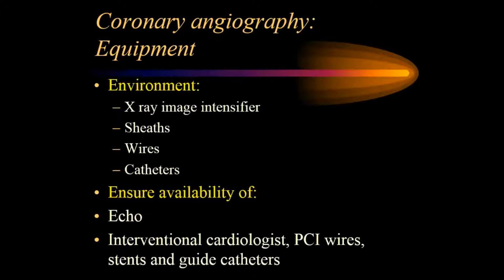And ensure the availability of echocardiography within the cath lab. You need an echo machine, a portable echo machine in the cath lab, in case you need to test for the development of tamponade or valve abnormality, etc.